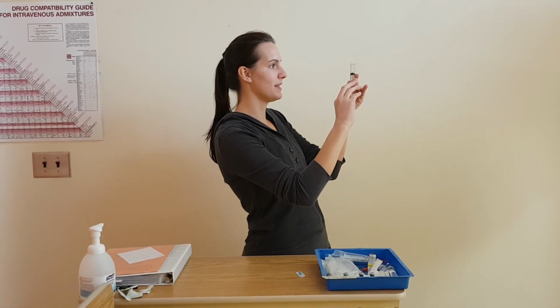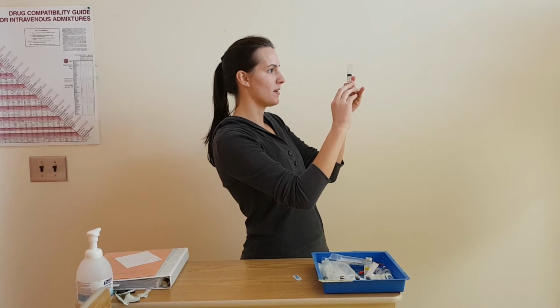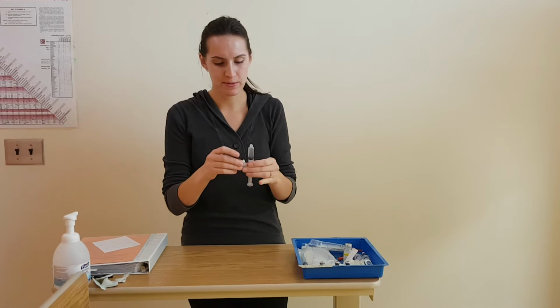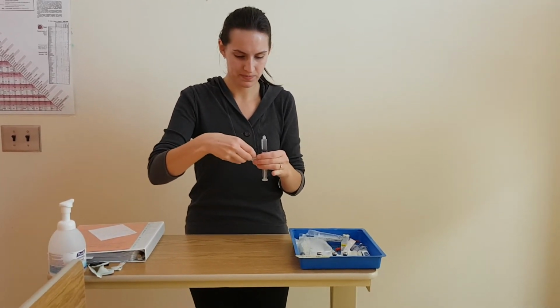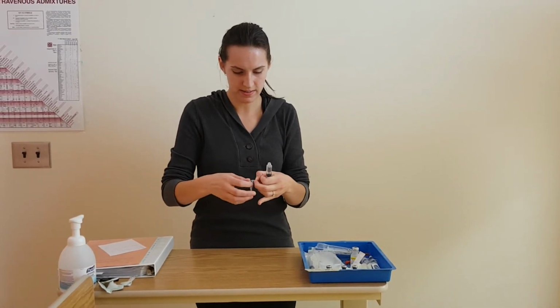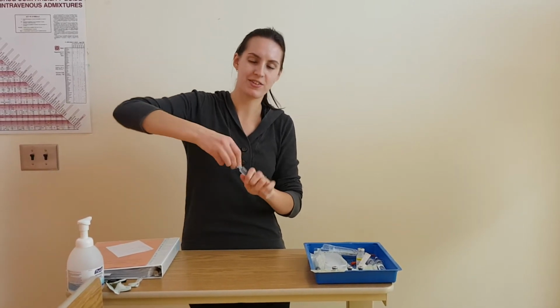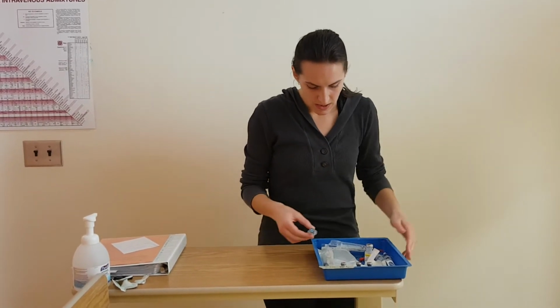So I will be needing 4.8 milliliters of sterile water for my injection. So I will need 4.8 milliliters. And at this point, since I am bringing this to the bedside, I'm just going to recap this with these little blue caps here. Okay. Be careful to not touch either tip of the syringe or this cap to maintain its sterility and prevent any introduction of microorganisms to my patient's injection site.